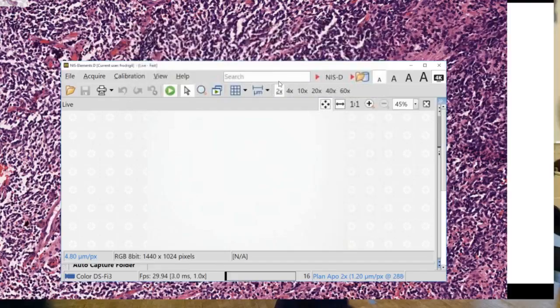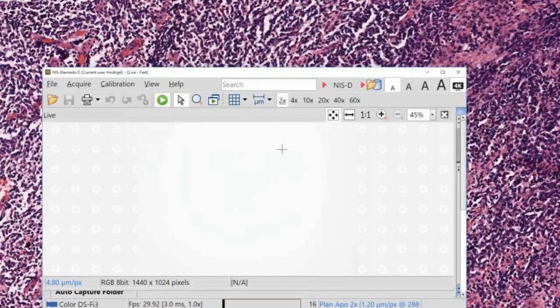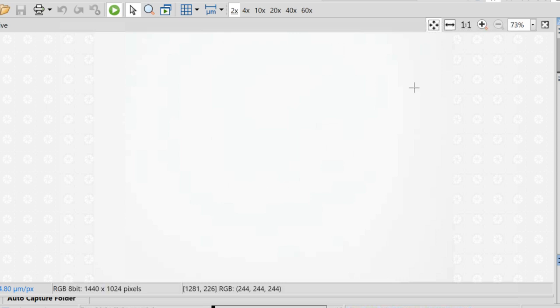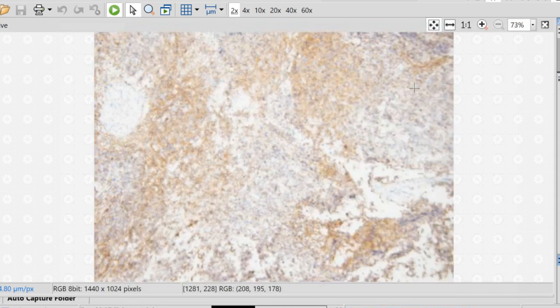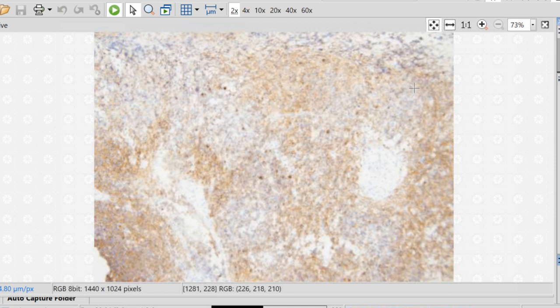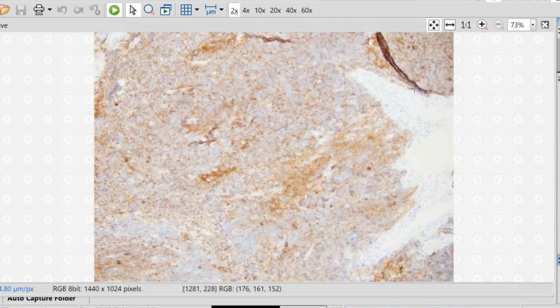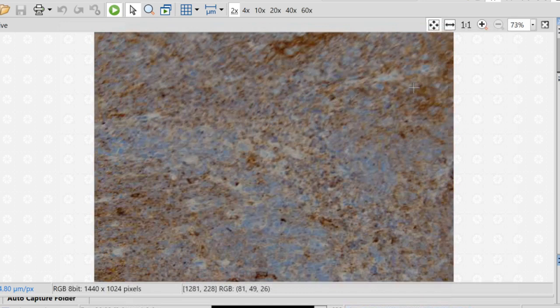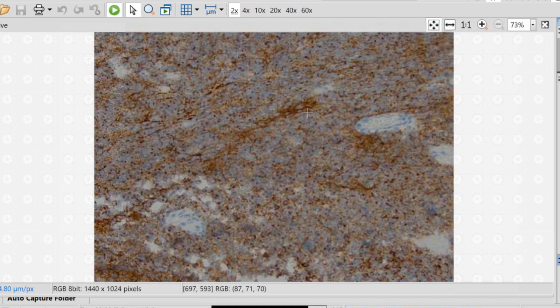We'll look at some immunostains now. A good marker to start with for medulloblastoma is synaptophysin, since almost all medulloblastomas show neuronal differentiation to various degrees. It is a good way to confirm neuronal differentiation. Synaptophysin will label the cells and also label areas of neuropil suggestive of neuronal differentiation in the stroma. So at least we are starting with a neuronal tumor.